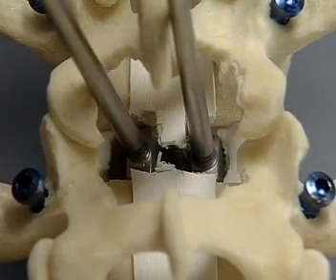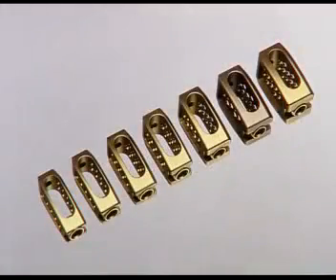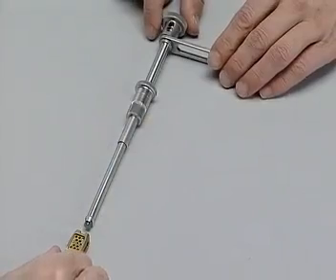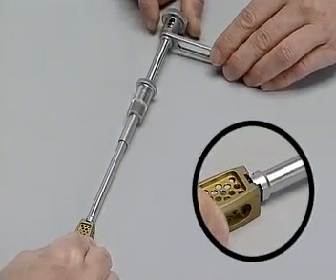The disc space has now been enlarged to its natural height. A radiograph should be taken at this stage to ensure the spreaders are in the correct position, which is the midpoint of the vertebral disc space. The contact fusion cage is available in seven sizes. The cage, which corresponds in size to the largest vertebral body spreader, is now connected to the holder.